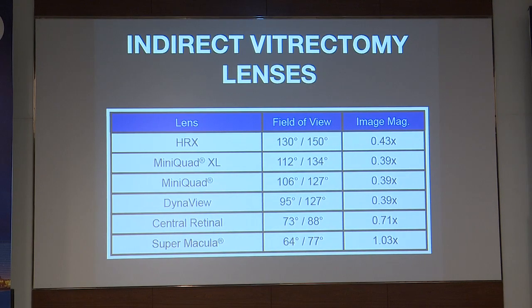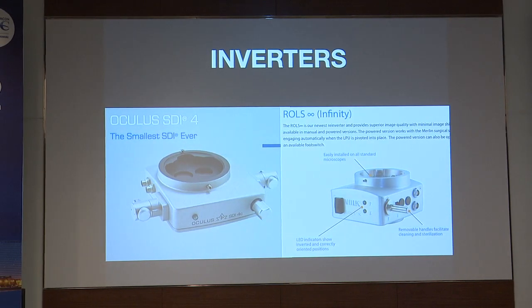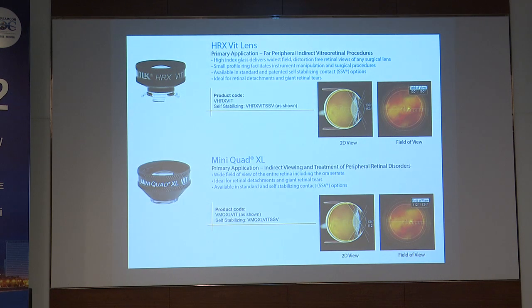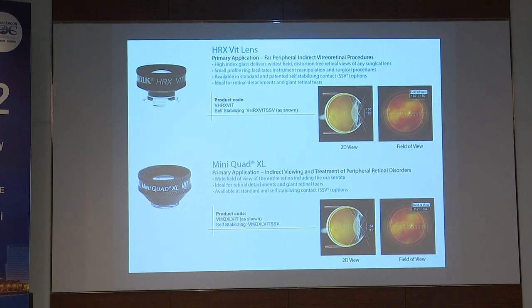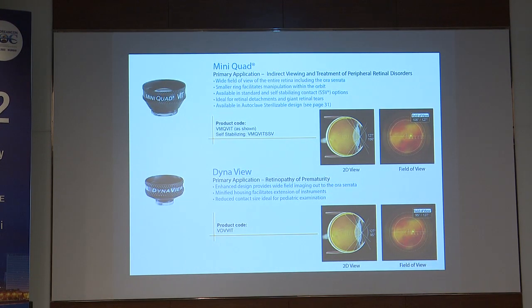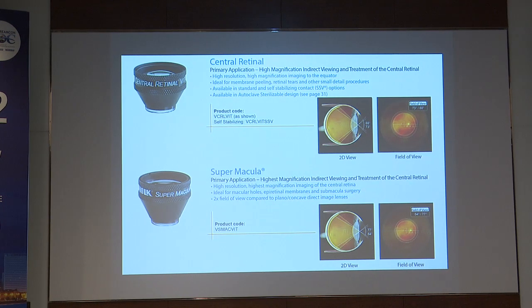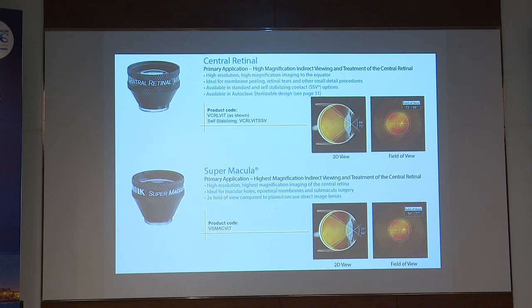Indirect vitrectomy lenses, this is the catalog from VOC. They have a wide range of wide field lenses and central retinal lenses. I'll come to them one by one. Of course, with the indirect lenses and the indirect viewing systems, you have inverted images, so you'll need an inverter. The Oculus one and the VOC one are popular choices. In wide field lenses, the HRX vitrectomy lens or the Mini Quad XL are the most commonly used, and they give a very wide view for vitrectomy, and you can see up to the ora very comfortably. And of course, there's a Mini Quad previous generation as well, and the DynaView, which is mainly used for pediatric surgeries. Central retinal and the Super Macula are both used for macular work and up to the mid periphery. The central retina gives a slightly wider view.